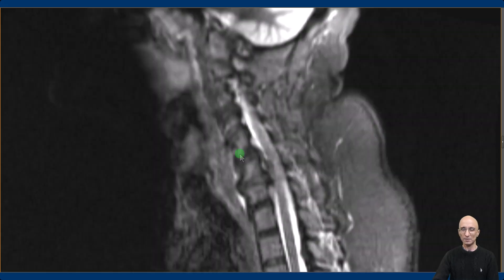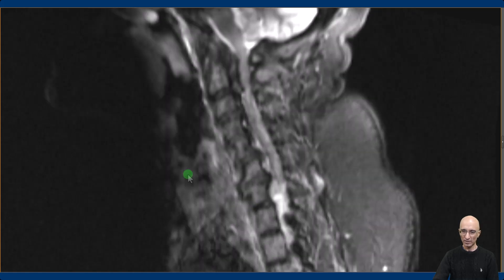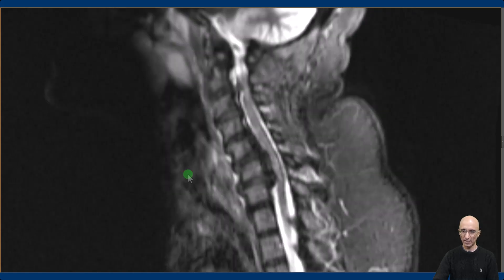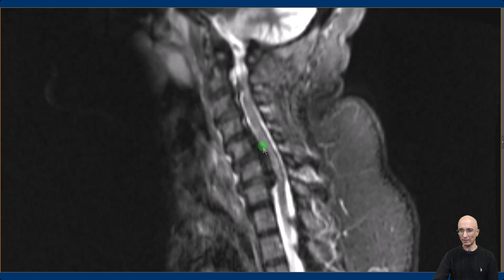Given the patient's clinical symptoms of inability to move her extremities, she underwent MRI cervical spine examination to evaluate for any potential spinal cord injury. On the sagittal STIR images we can see mild pre-vertebral edema. There is also mild edema in the interspinous ligaments. We can again see ossification of the posterior longitudinal ligament causing severe narrowing of the spinal canal, and we can also identify spinal cord edema at C5-C6 level.